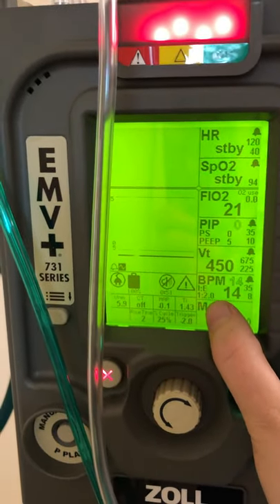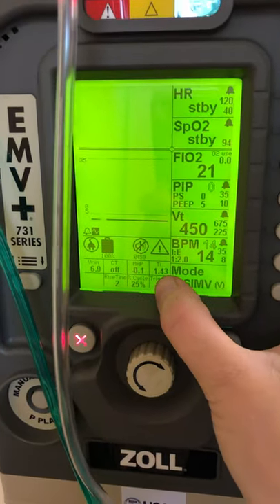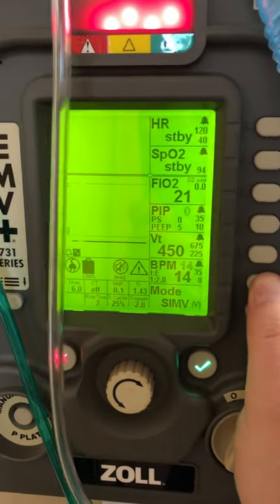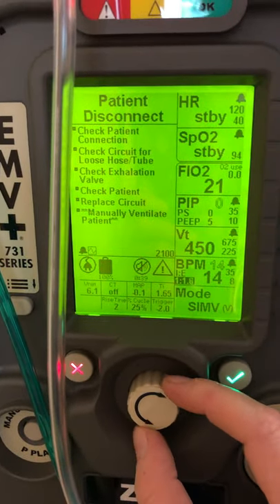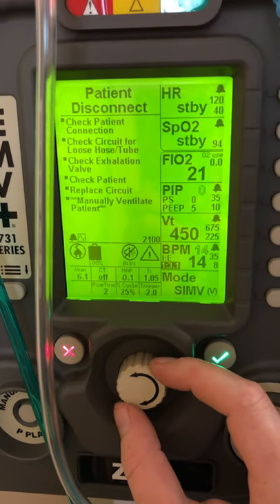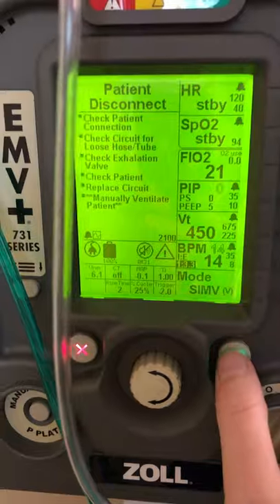We also have our IE ratio here. The default IE is 1 to 2, which gives us an inspiratory time of 1.43 seconds — that's a little bit slow. I'm used to setting my TI, not my IE. So I'm just going to look at my TI here and change my TI to about 1 second, because that's normal for an adult. Green check mark.